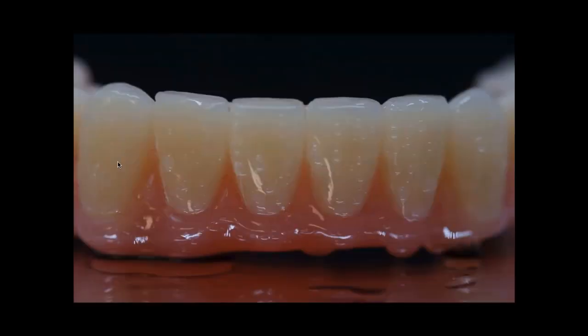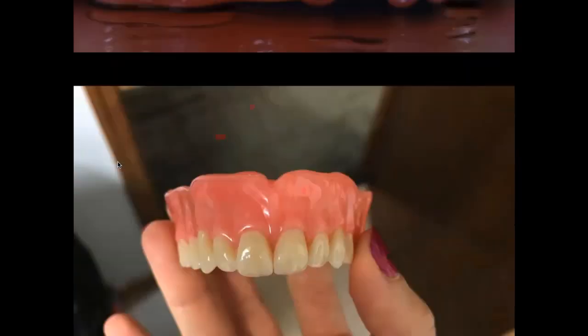The materials. Again, this is a hybrid with the conventional resins we're used to, with the milled base material, all monolithic and all a great product to use when you don't have vertical space, when you need to have something that's not going to break, when there's a lot of heavy forces. And people ask me, do these products look ugly? Do the teeth look bad? And I would say, no, they look really nice.